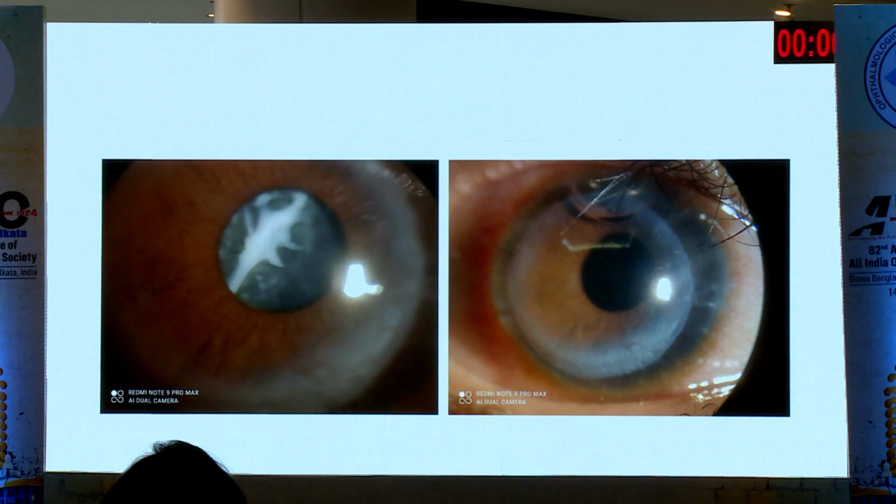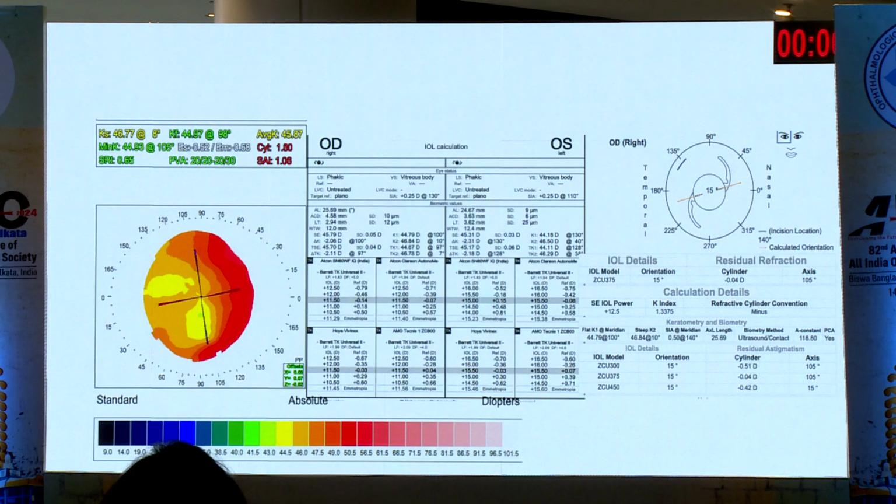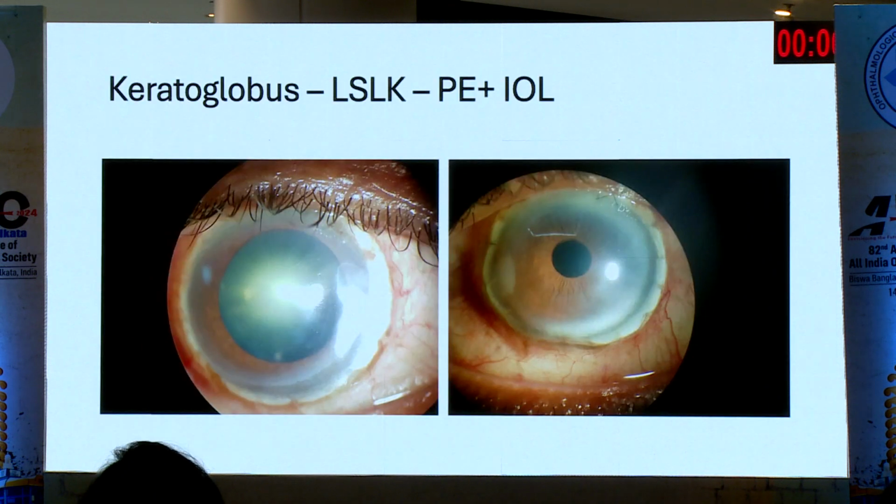So this was a patient who had a PK. The patient had atopic keratoconjunctivitis. Somebody had planned an LK, but it ended up with a PK. So the PK part was fine, sutures were out, but she has a shield cataract. So we went ahead and did a toric IOL. It's not a very regular bow tie, but it was kind of matching the refraction that we had, and we went ahead with a toric lens, and she ended up with a 0.75 SEQ, improving to 6/6.